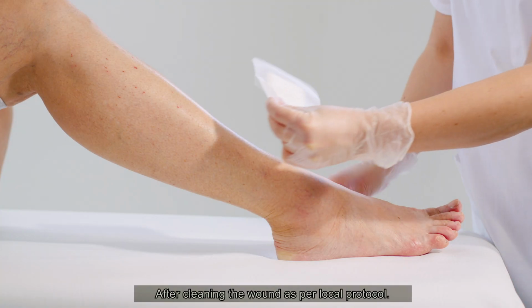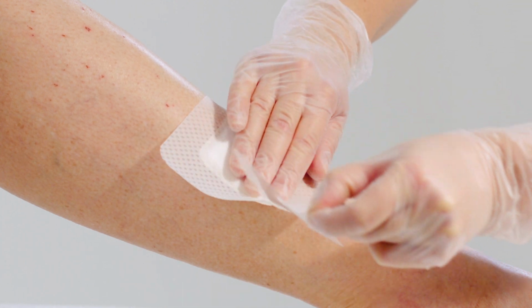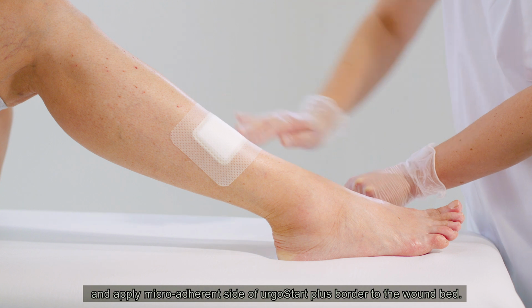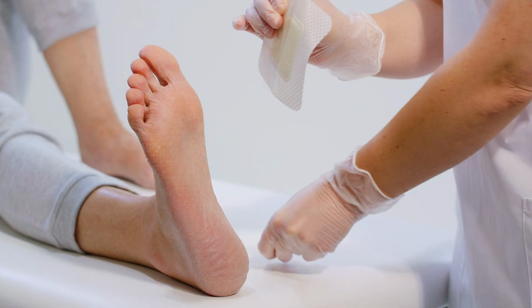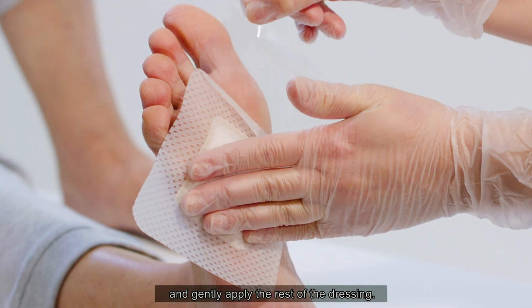After cleaning the wound as per local protocol, pat dry the wound with a sterile gauze. Remove one side of the protective transparent film and apply the micro-adherent side of UrgoStart Plus Border to the wound bed. Then remove the other side of the protective film and gently apply the rest of the dressing.